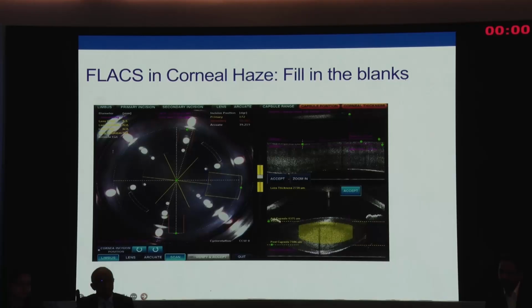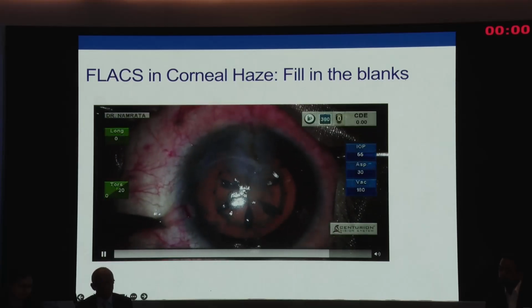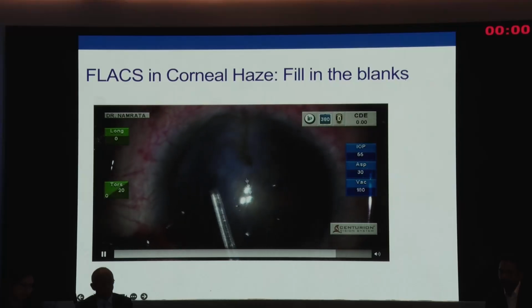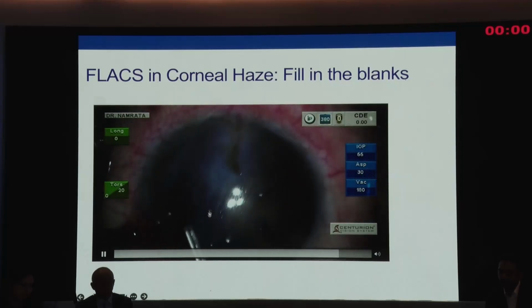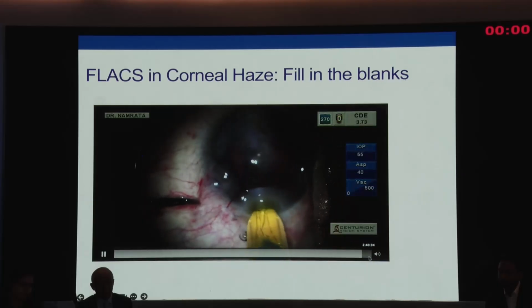Then femtocataract and corneal haze, and I'll just show this last video to show, I think it has a huge role to play. It is fill in the blanks. So it'll cut some places and not cut some places, but that doesn't matter. So you have to fill in the blanks. Rexis is not here, so you just fill it up. CHOP is not here, so you just do it manually by rotating it. I think, again, it has an important role to play, and it works well.